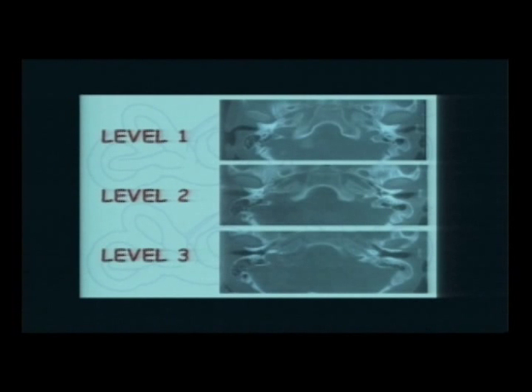So if we take a horizontal cut in the temporal bone, and this is the inferior basal turn, this is going to be my first cut. And then we're going to see the basal turn several times all the way up, because we're actually slicing the temporal bone horizontally along the basal turn, which is vertical to that plane. So this is the beginning of the inferior basal turn that we can see in this part.